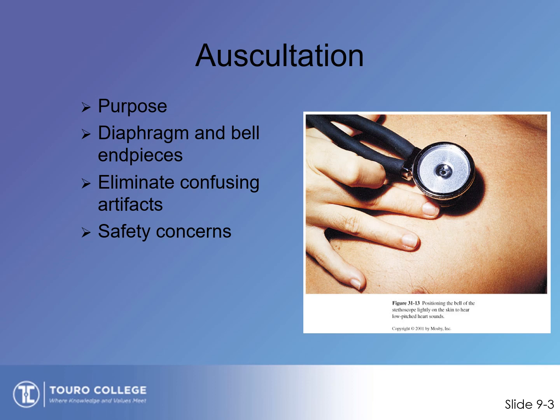Most of them have a diaphragm and a bell. The diaphragm is used for high-pitched sounds like breath, bowel, and heart sounds. The bell is best for low-pitched sounds like an extra heart sound or murmur.